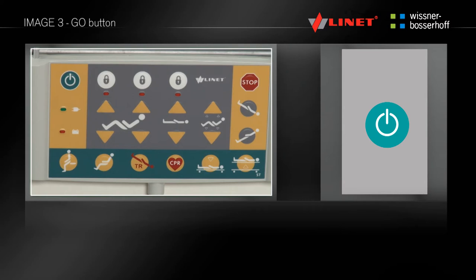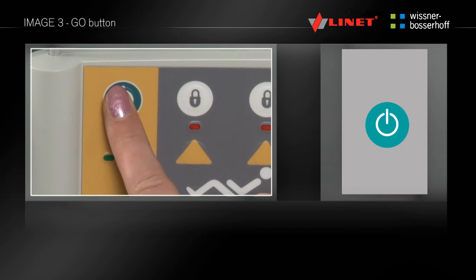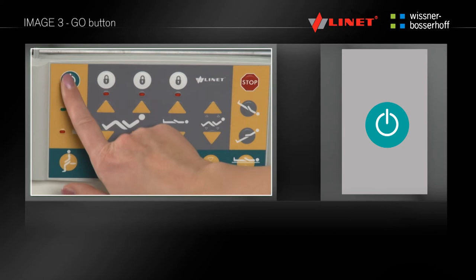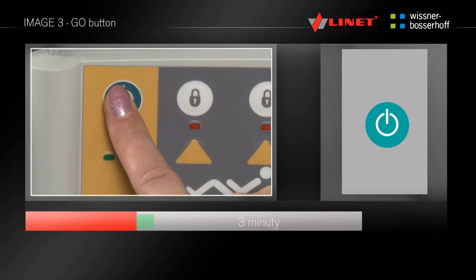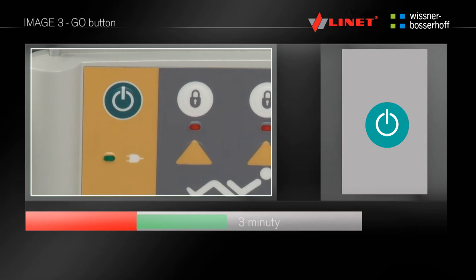For safety reasons, the electrical functions of the bed are automatically deactivated, eliminating unwanted bed positioning from accidental button pressing. Electrical bed functions can be activated using the go button, located on the supervisor control panel and manual control. Pressing the go button activates the electric functions for 3 minutes, and during this period it is not necessary to reapply the go button. The activation time is automatically extended by using any function.